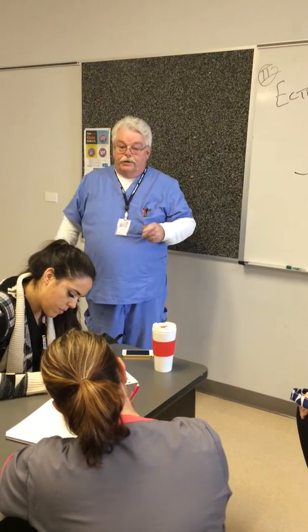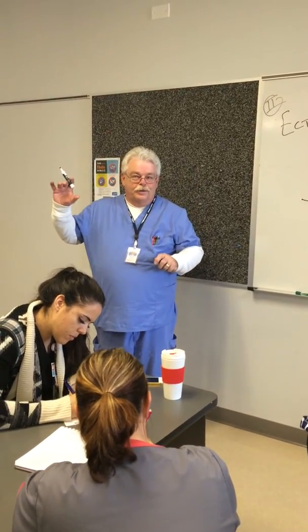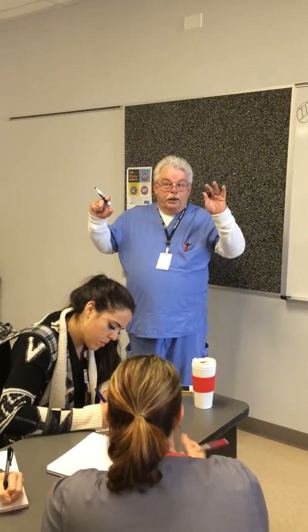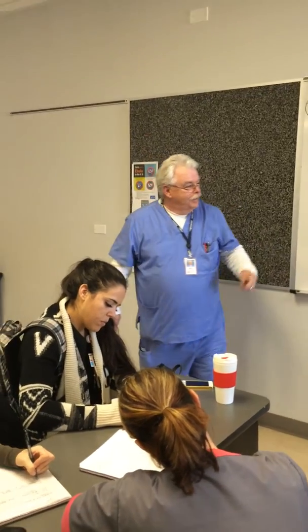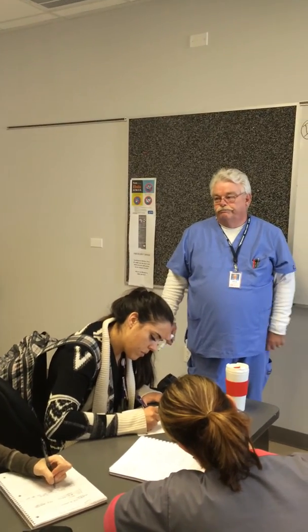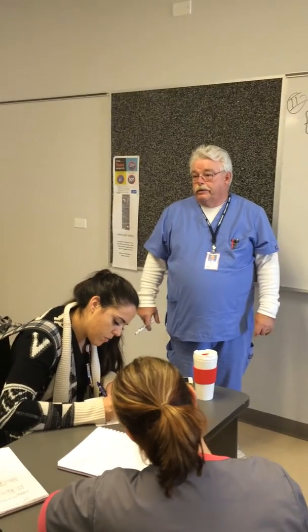QRS, PVC, bigeminy. Thinking caps. QRS, PVC, PVC. Anyone? Bueller? Trigeminy. Okay, 3. QRS, QRS, PVC, trigeminy. All right. So bi, tri. 2, 3, those are the magic words.